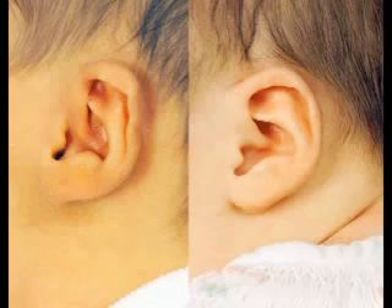In these instances, the reshaping of the helical rim is very effective with molding techniques involving the ear well and the retractor system.